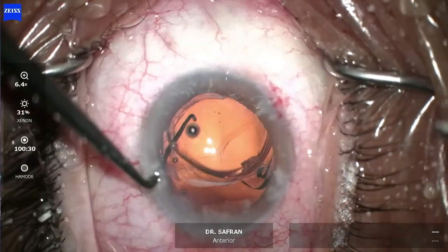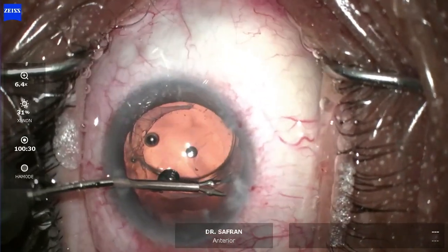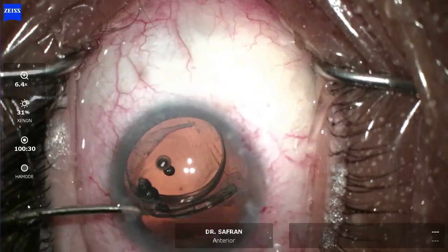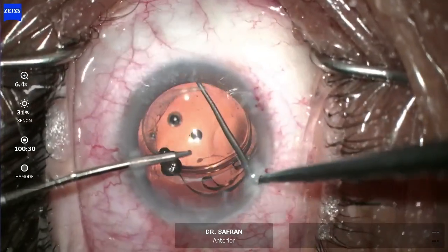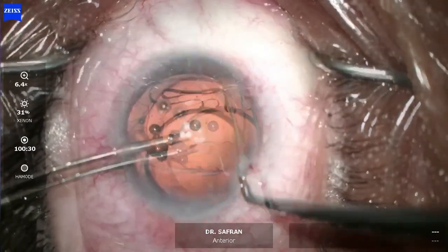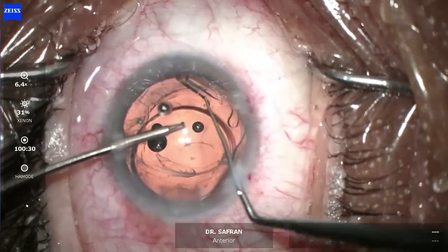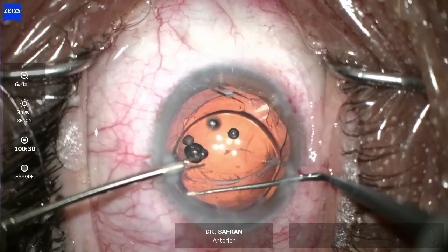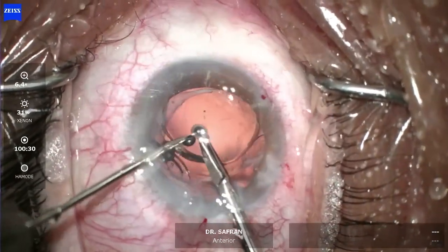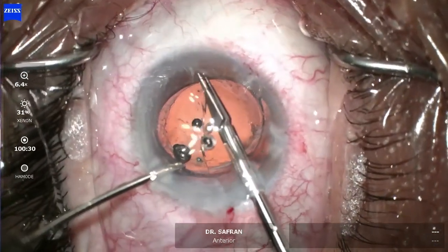Now I'm going to rotate the lens a bit within the bag to make sure it's freed up, and I can go ahead and pull this haptic out of the bag. These hydrophilic lens haptics are very soft and spongy. The hydrophilic material is prone to calcification over time, and we don't want to leave this lens in there and have that happen — it's already a bit hazy, as I showed earlier.